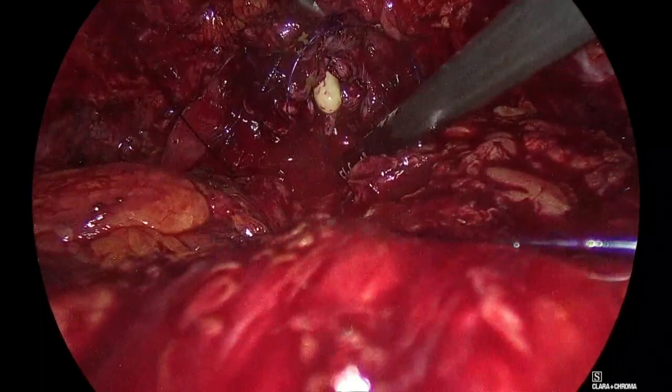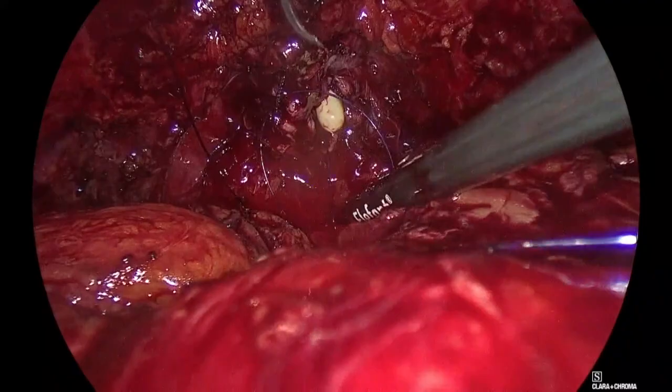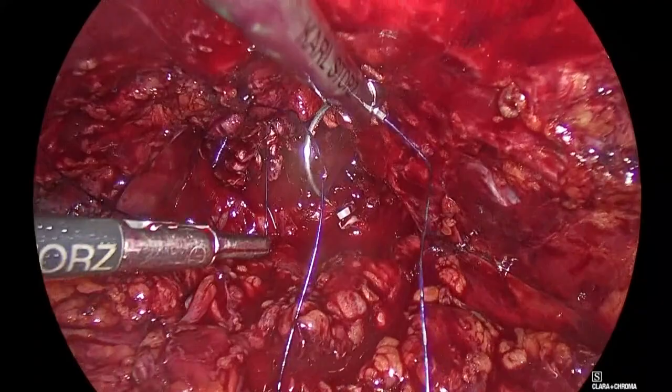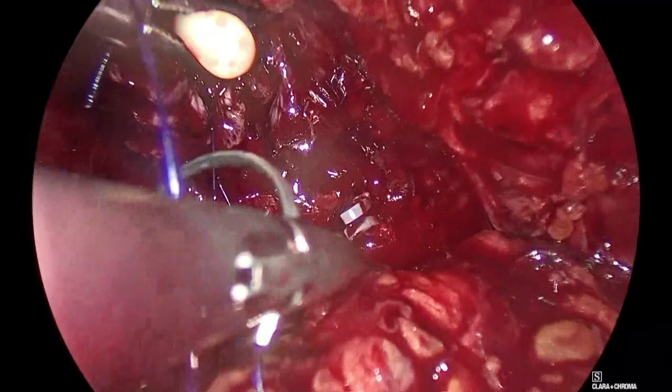Please increase the pressure by 2. Go here, Panayotis, with your grasper. Take the fat away from me. Come in. Catheter in, please. Good. Stop. Tampon. 6 o'clock.